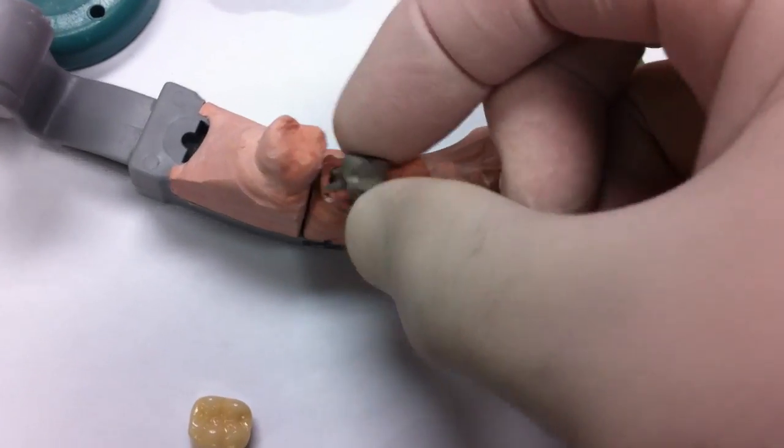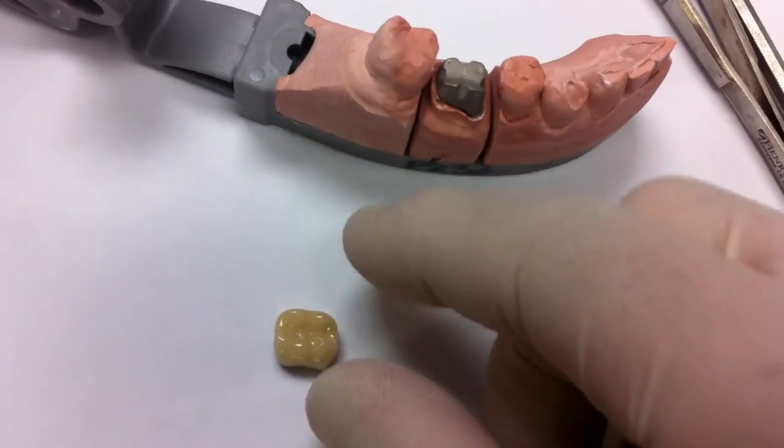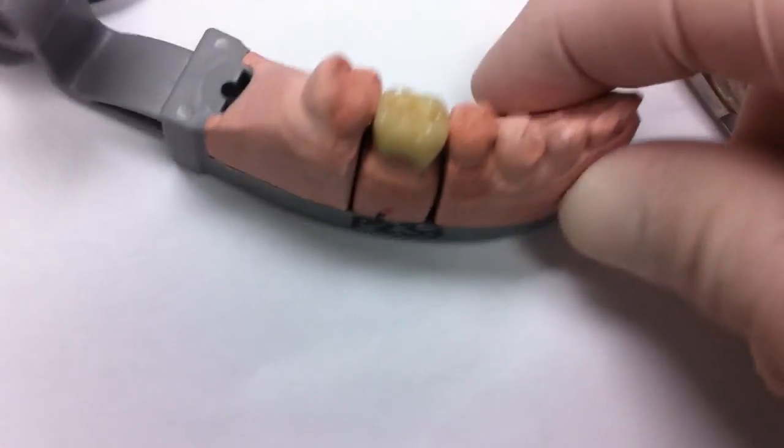Here I am inserting the post — right there. That's how it fits. And here's the crown that goes onto the post. As you can see, it's a perfect fit.